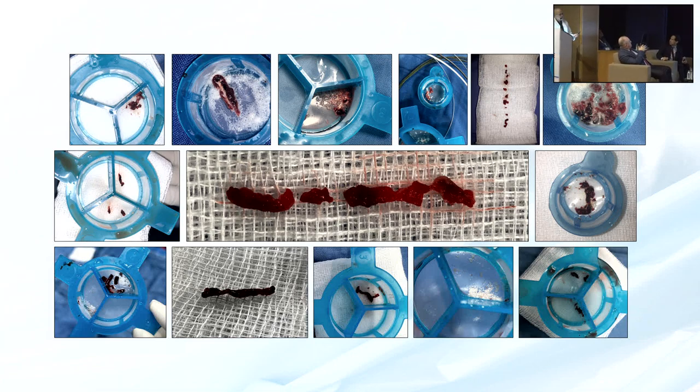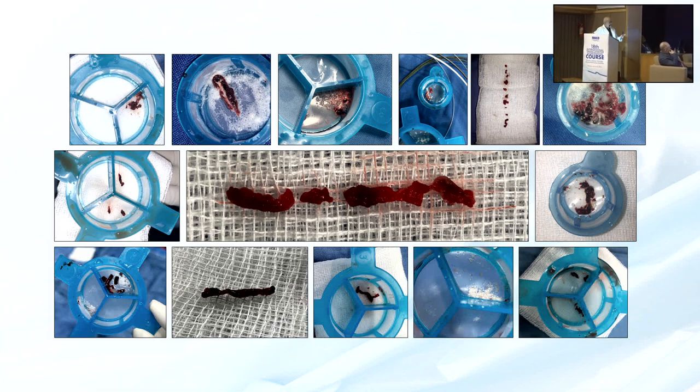But the only problem that I can understand is that this can work, but if the thrombus is more than a day or 36 or 48 hours old, then it can create a problem. But yeah, that has to be kept at the back of your mind. And why I use balloon assisted deep intubation is just to avoid a razor effect and prevent the intima damage as much as I can.